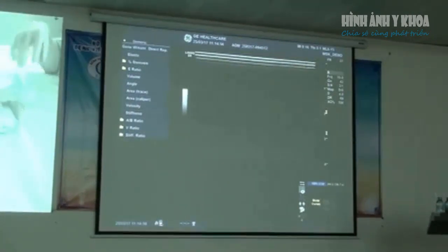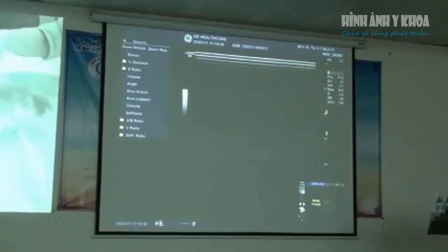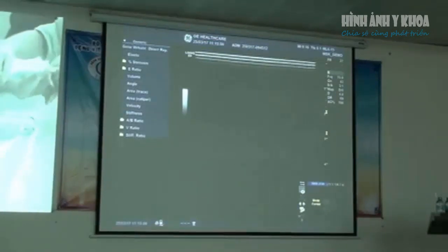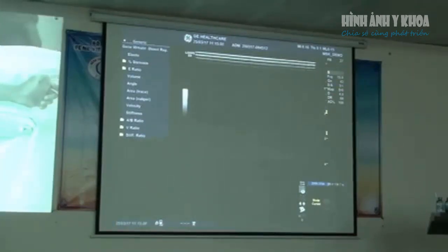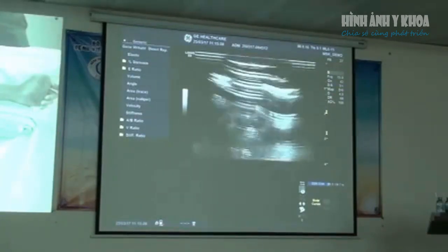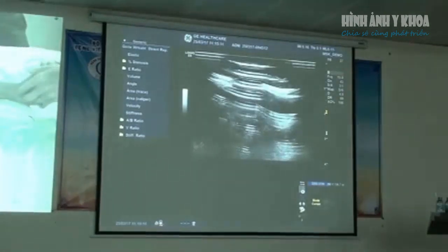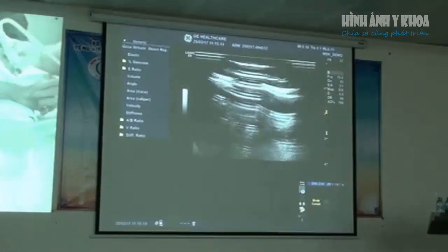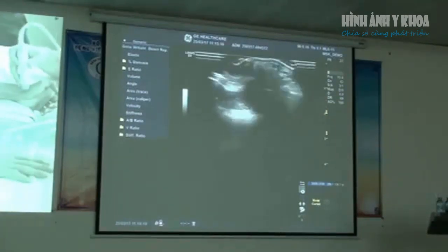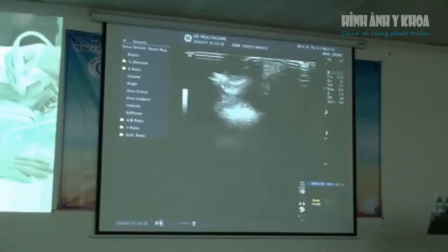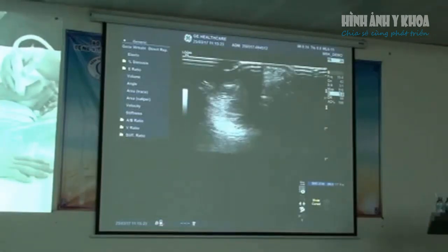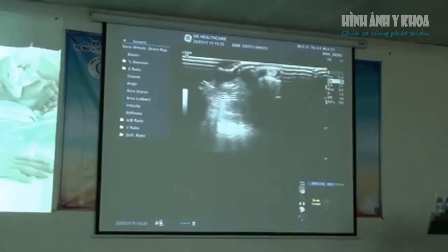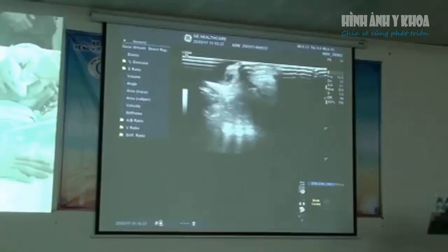If we look at the wrist, I'm looking for compartment one. Just get the patient to relax their hand and relax their thumb. I generally use high frequency and native imaging. I don't use harmonics a lot.